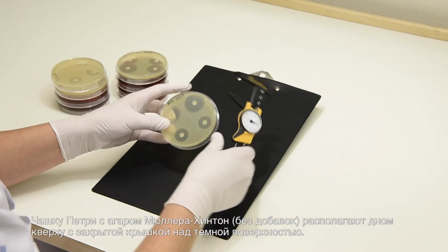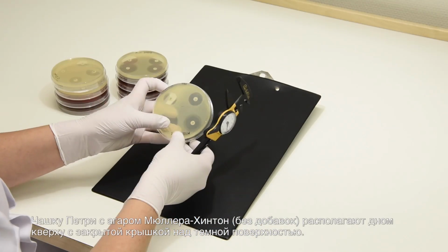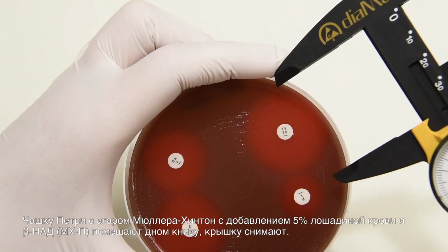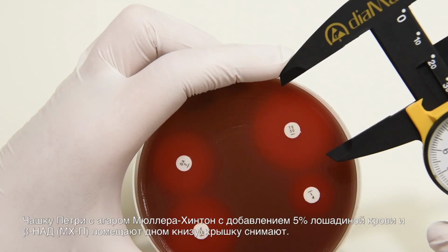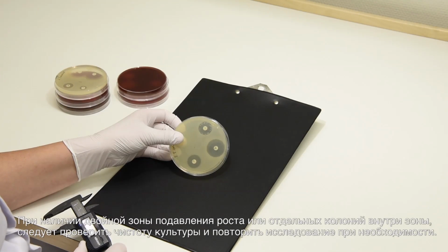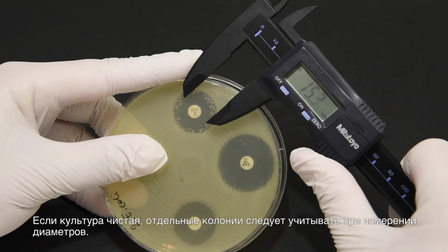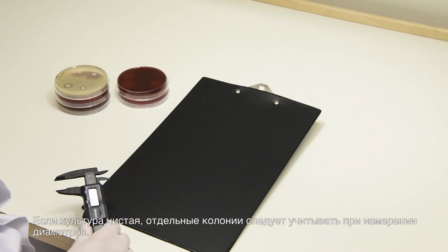Read unsupplemented Mueller-Hinton plates from the back of the plate against a dark background. Read Mueller-Hinton plates supplemented with defibrinated horse blood and beta-NAD, so-called MH-F plates, from the front of the plate with the lid removed. In case of double zones or distinct colonies within zones, check for purity and repeat the test if necessary. If cultures are pure, colonies within zones should be taken into account when measuring the diameter.